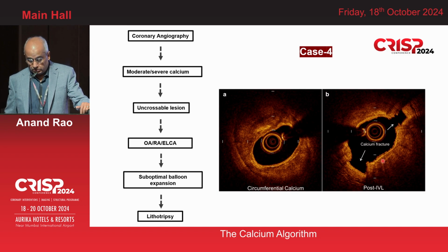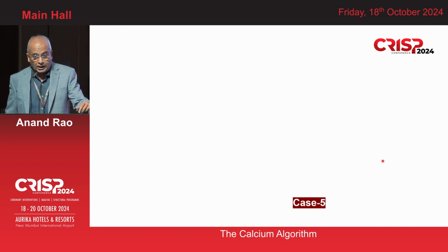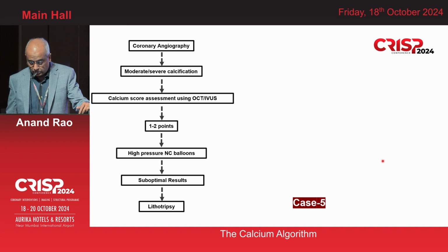Recently we had 2 cases with severely calcified SVG grafts, only 3 years old, and very severely calcified. It's amazing, 3 years and they were so calcified. It was like I had to do a CTO. Then we did imaging and saw severe calcification. None of the balloons opened, and even the IVL 120 pulses did not open. So we left it at a suboptimal result. So I don't know about IVL in SVG grafts. That's one concern out here.